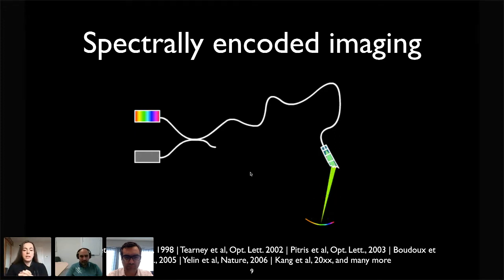This is what's displayed here. And this is where we started. So my first contribution was designing the laser that changes rapidly in time. So we now have lasers that can change 100,000 times per second. So we can do imaging that is very rapid.